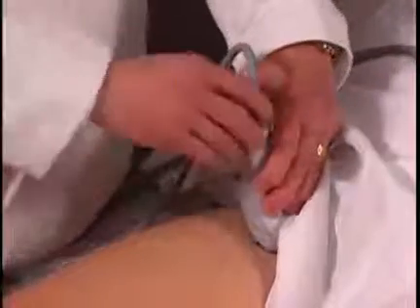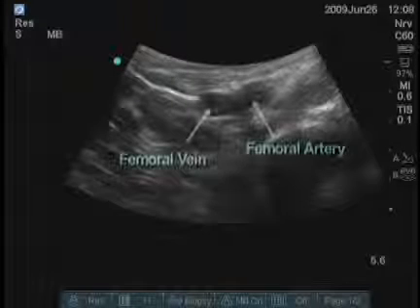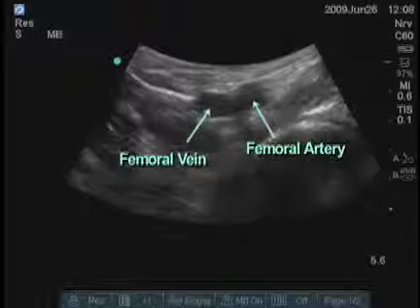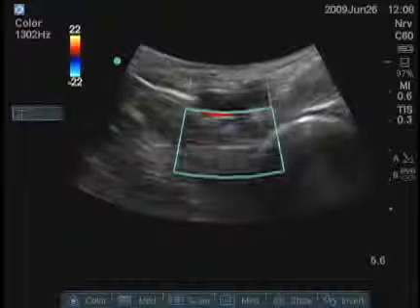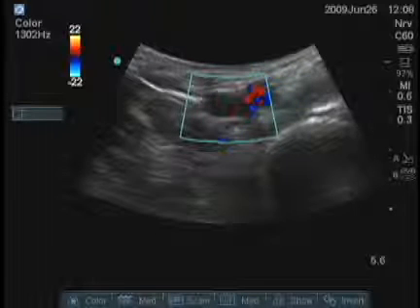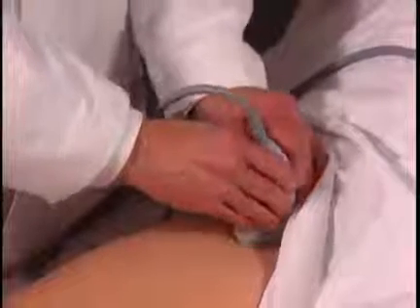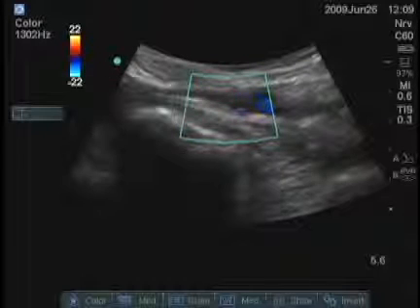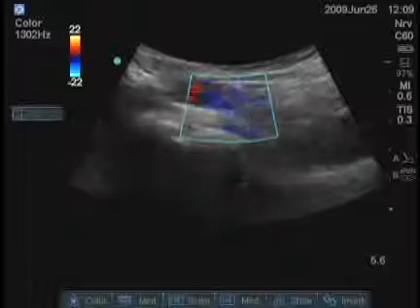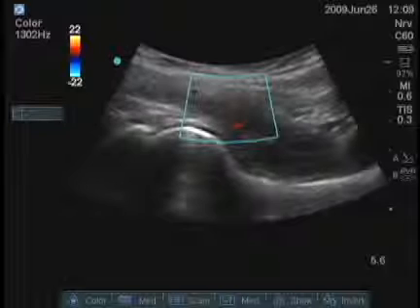Before you do anything, you want to identify the great vessels. I will turn the transducer transversely and look medially, and we can see the anechoic structures that are pulsating. I'll turn on the color — you should be able to confirm that those are the vessels, and we want to obviously avoid those. When I turn back longitudinally, I see that those vessels are medial to where I was looking before, and now that area I've examined does not have blood vessels.